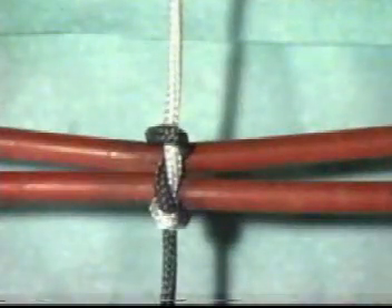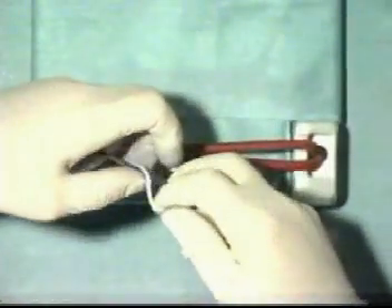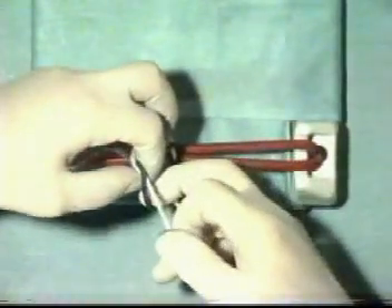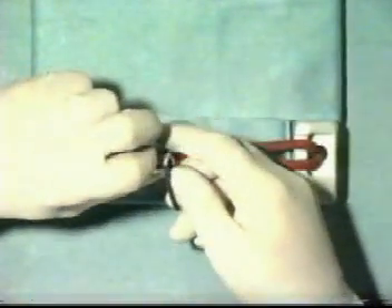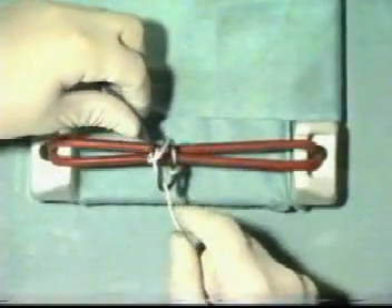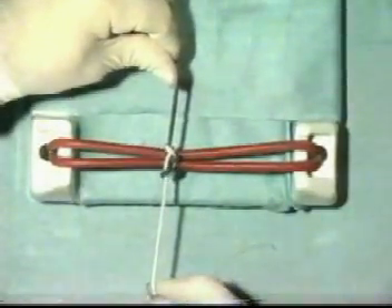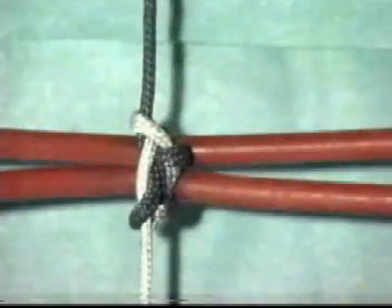As you can see, it doesn't look very pretty with this thickness of thread. However, repeat the same procedure — one throw, as for the reef knot, and then take the thread through a second time. And once again, snug down the second throw. And although it looks somewhat cumbersome with threads of this size, it's a very secure knot. Thank you.